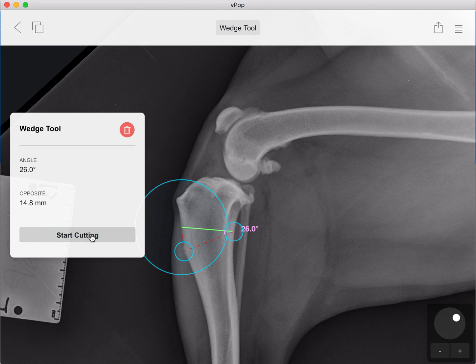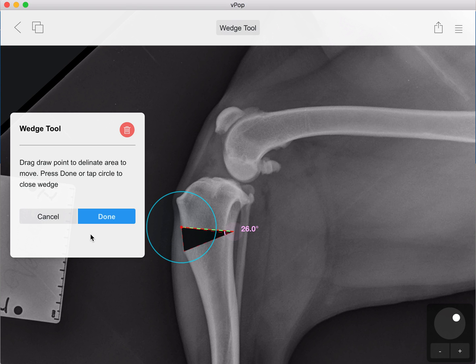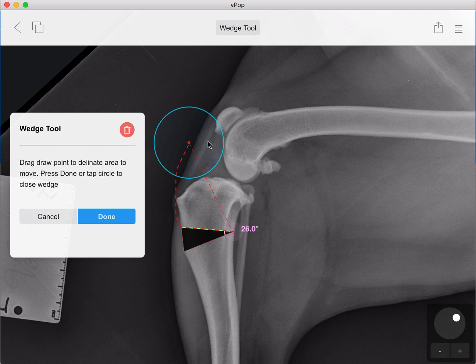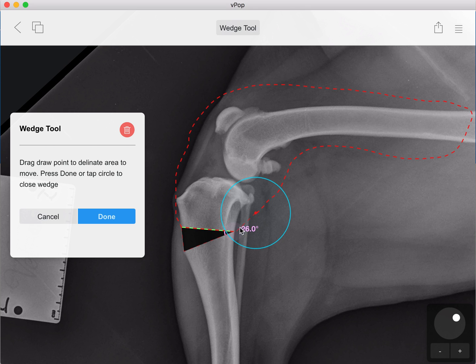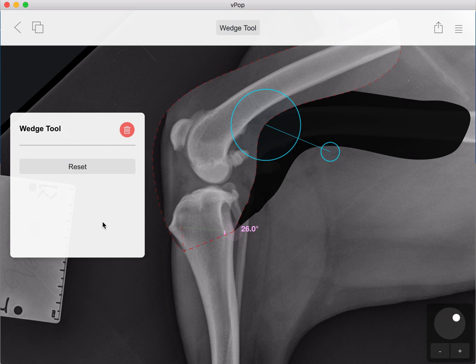The second step is simply to remove the wedge. In one quick click we can remove that as step two, and then step three is to reduce this ostectomy. VPOP is asking you to draw your point around the fragment that you want to move and reduce. VPOP will join the start and the finish point together by the shortest point distance, so we can leave that and just click done and it will automatically reduce our fracture.